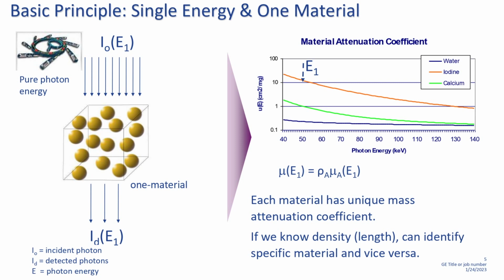So we have one material here. Okay, one material. We don't know. Maybe water, let's take. We are putting one energy beam, so we are putting an 80 kV beam. This is E1. Let's take E1 as 80 kV. So I put I0, the original intensity. This material is water. It will undergo what? Attenuation. Correct. So what you will get is the measured value. This is your original X-ray and this is the material which will undergo attenuation, and this is your measured intensity.